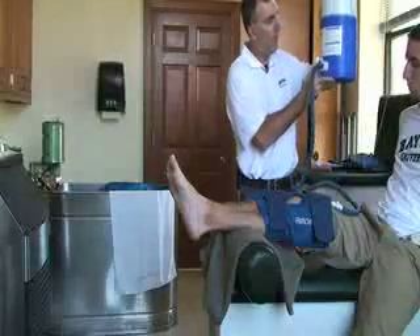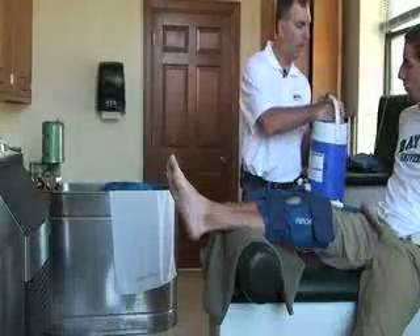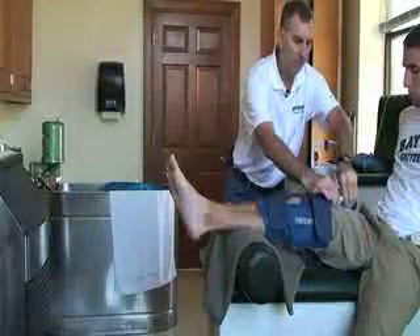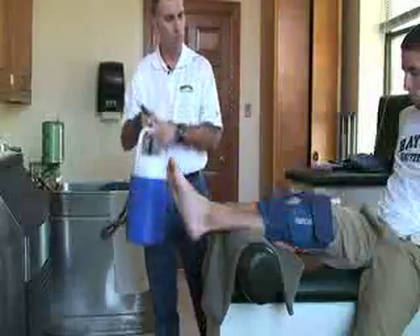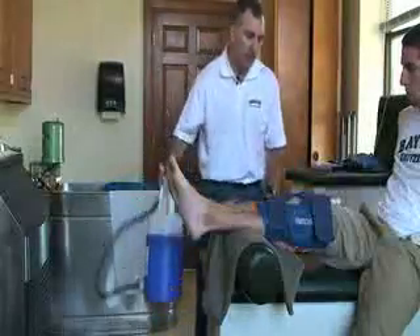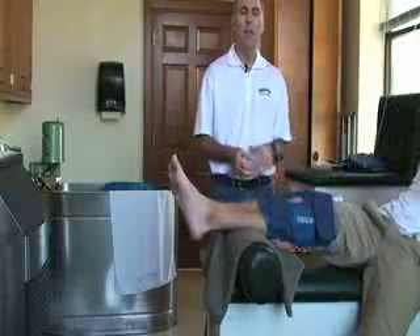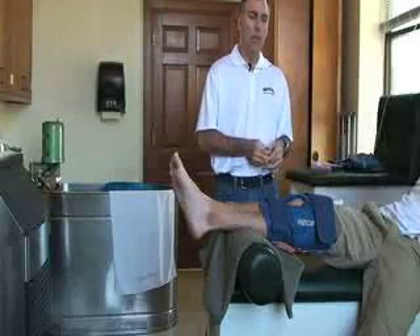Once the cuff is all filled, close the air vent and disconnect the tube. Then set the timer for the treatment — about 20 minutes. Ask the patient if there is any discomfort or if it feels okay, and instruct them to let you know immediately.